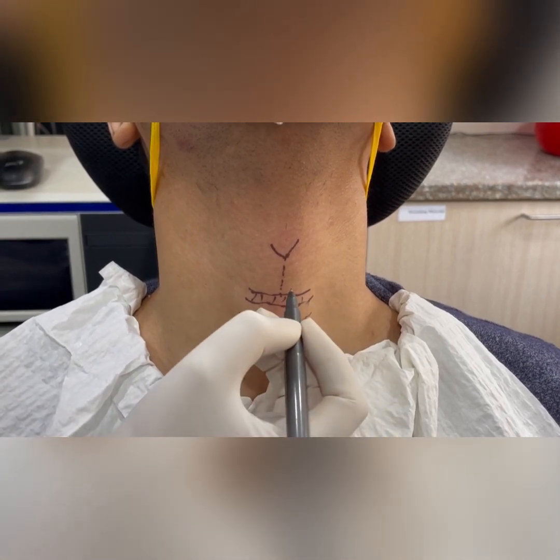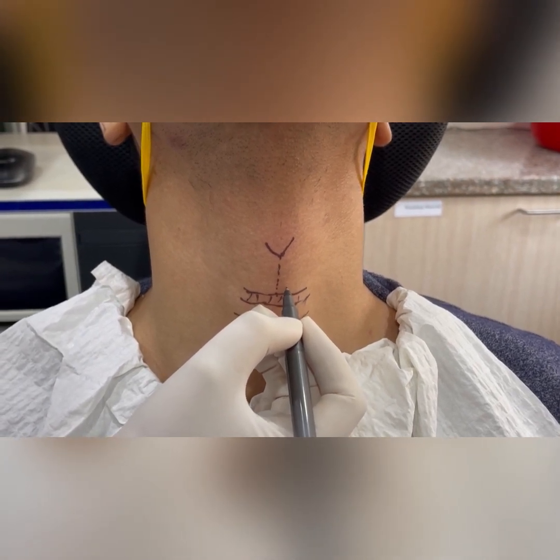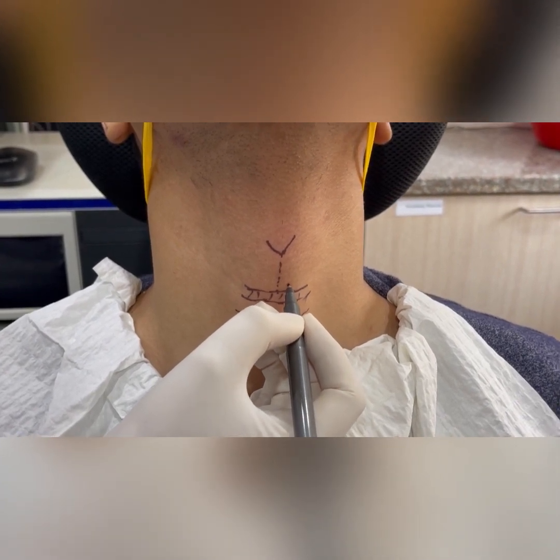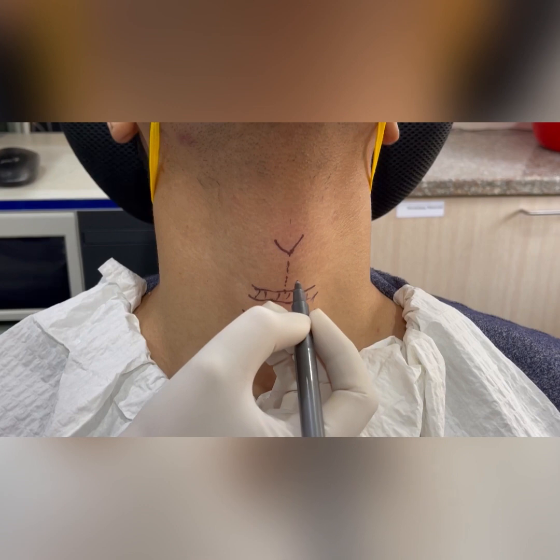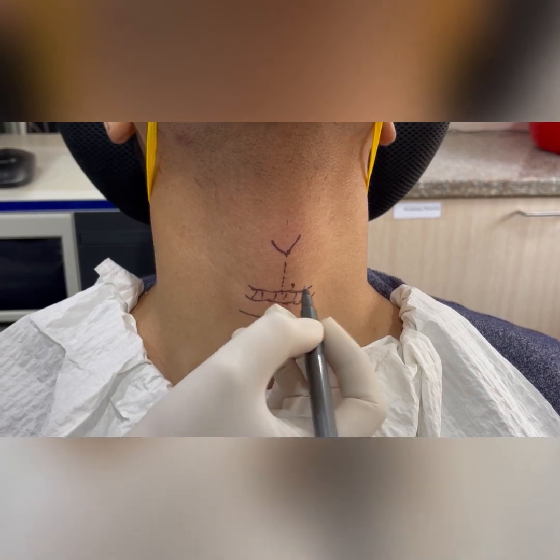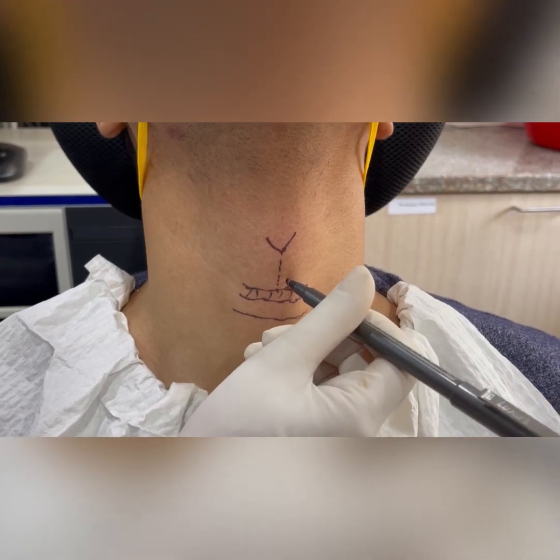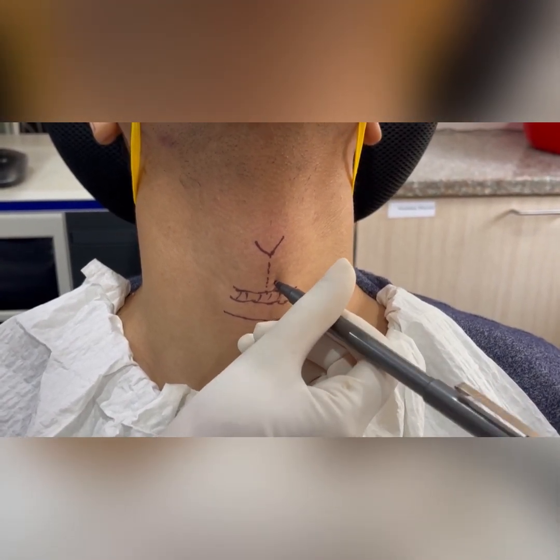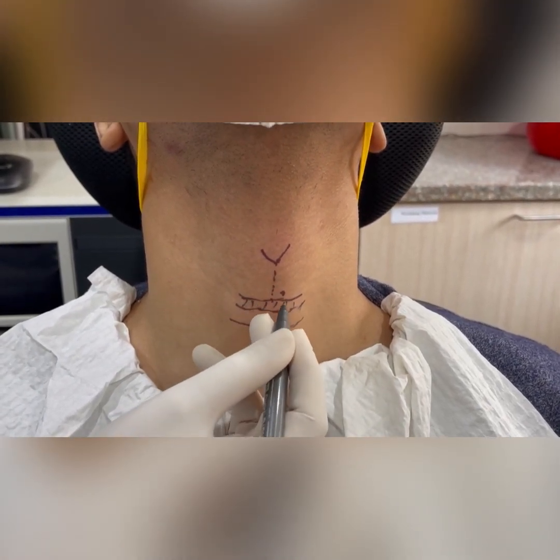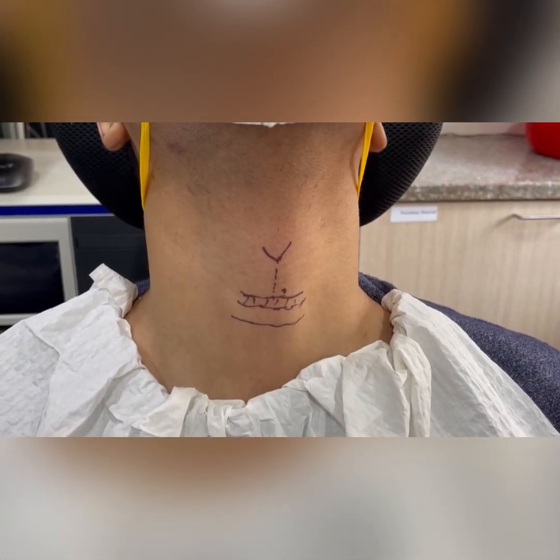If we are doing a left injection laryngoplasty, we go from the midline of the thyroid ala about six to seven millimeters in a male and three millimeters from the lower border. In a female, you may want to go four to five millimeters from the midline, and again three millimeters from the lower border. The needle is inserted 90 degrees to the surface in a boring action, after the two percent lidocaine with adrenalin injection has already taken place and the patient has been adequately nebulized with lidocaine.